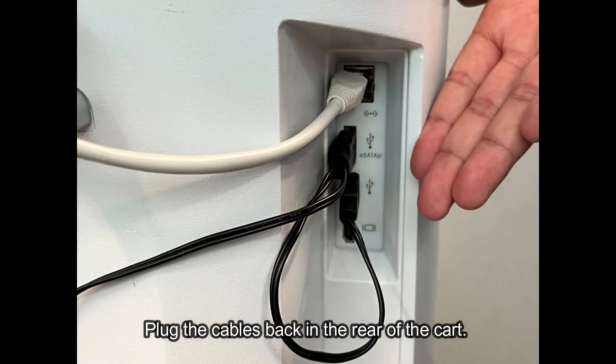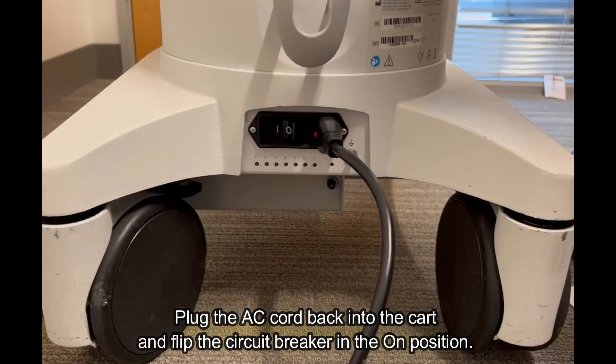Plug the cables back in the rear of the cart. Plug the AC cord back into the cart and flip the circuit breaker in the on position.